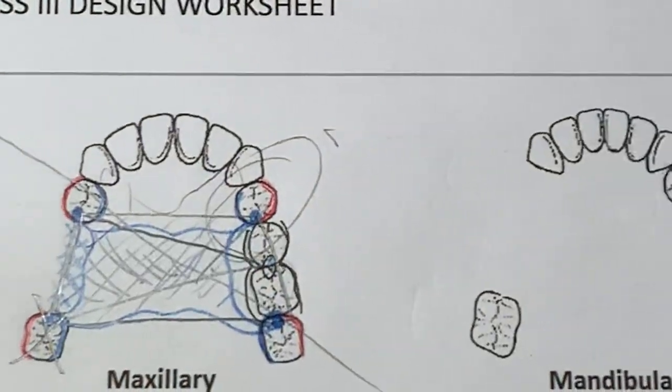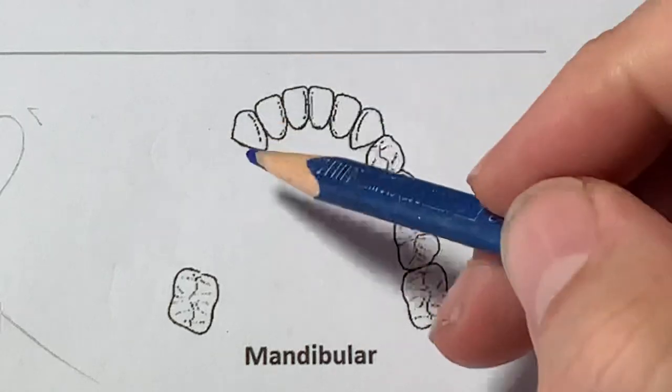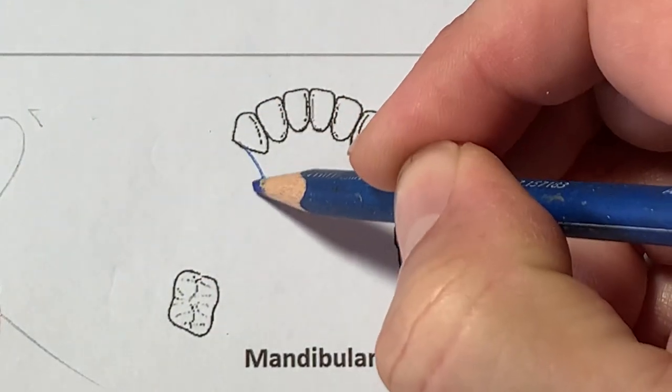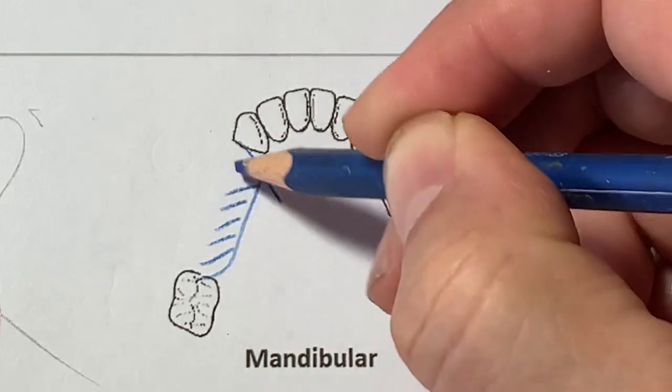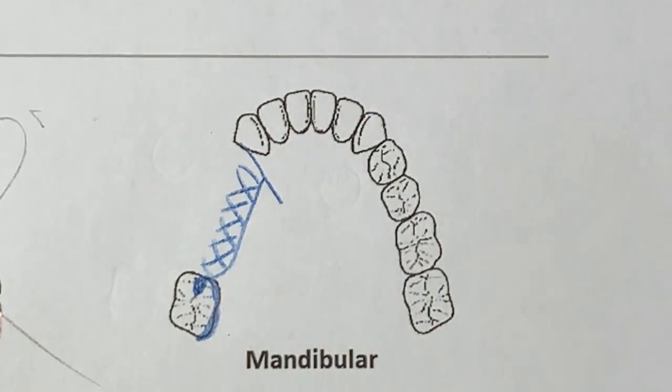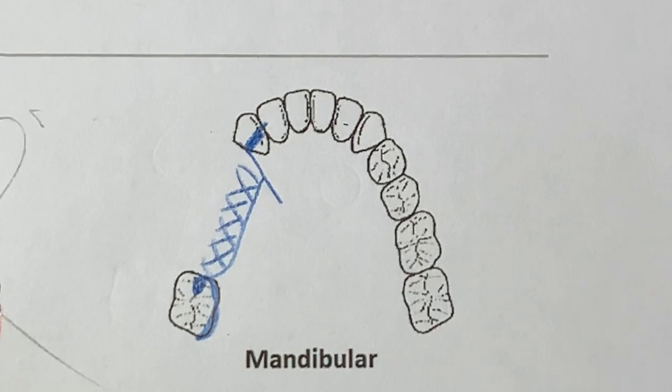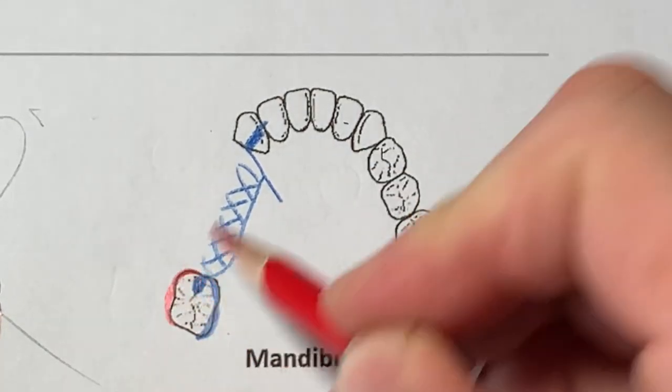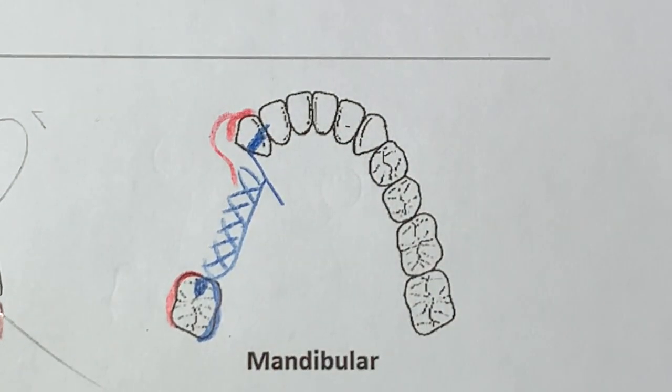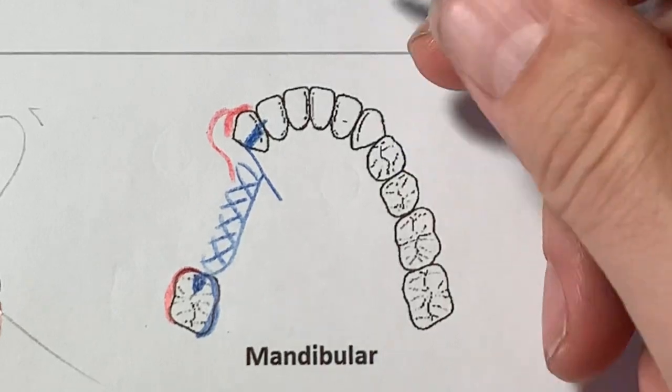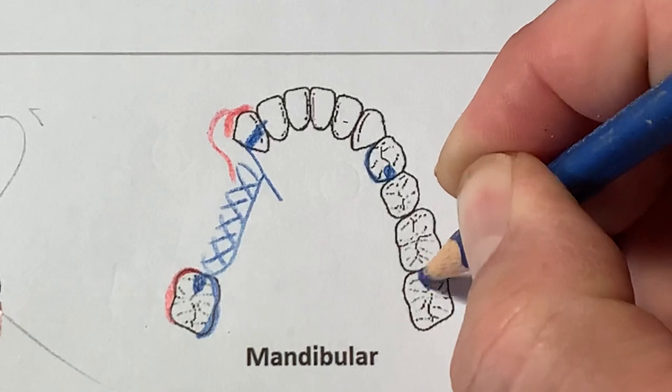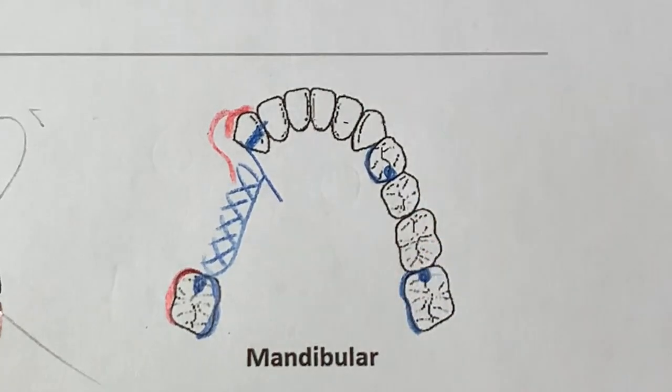So there's our first Class 3 design, and now we're going to do the unilateral edentulous base Class 3. This is Kennedy Class 3 we're talking about. On the lower, outline the edentulous areas, clasp the teeth adjacent to this edentulous area in the simplest form possible. Obviously keeping undercut and aesthetics and function, everything in mind. Now again, on the opposing side, there's no modification here at all whatsoever. So if we can, we'll try to move one as anterior as possible, and one as posterior as possible.